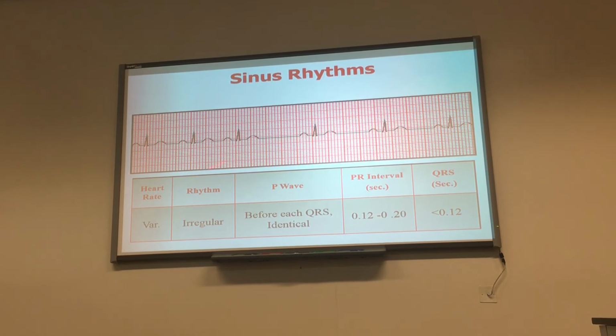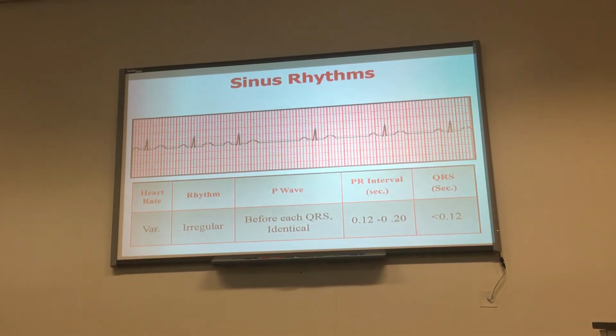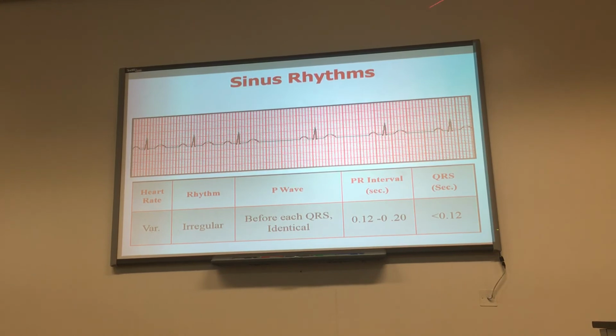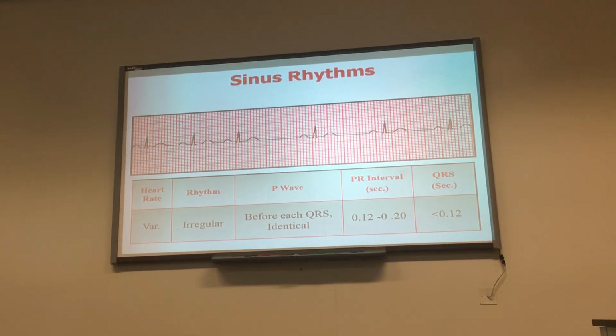So sinus arrhythmia is common in pediatric and young people. It will disappear with time. How to know it? I see clearly sinus P waves. I see the rate here is faster, then slower. This is inspiration, this is expiration. And it will repeat itself with inspiration. And if you're in doubt, when you're doing the ECG, we ask them to take a deep breath, and we label it, expire, and then you see it is the same. So it's common in what? In young people.